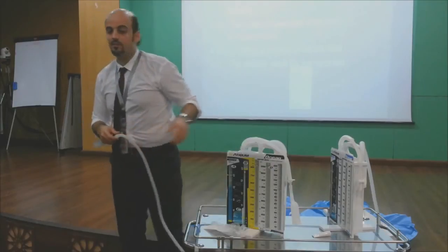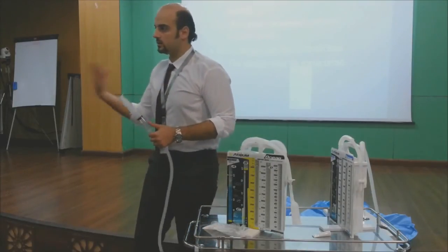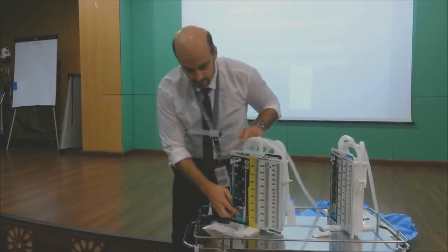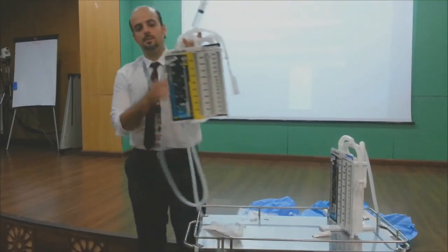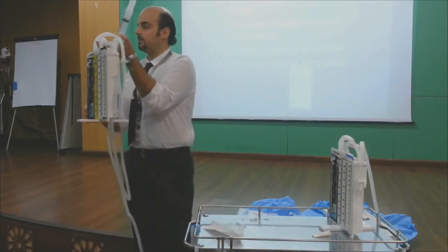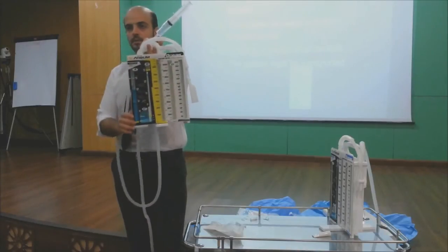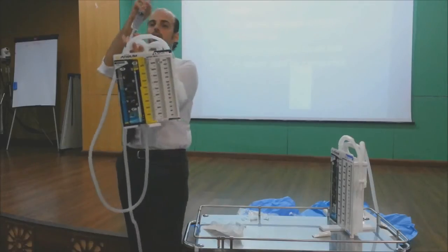Yeah, I know. If there is an air leak, an injured lung, like we said before, and the air continues to come from the lung, and there is suction, you will see the air leak where? Here. I want to ask you a question. Are the bubbles that we see in the negative chamber, or suction chamber, an air leak? No, it's not an air leak. What is the air leak? This is the air leak.